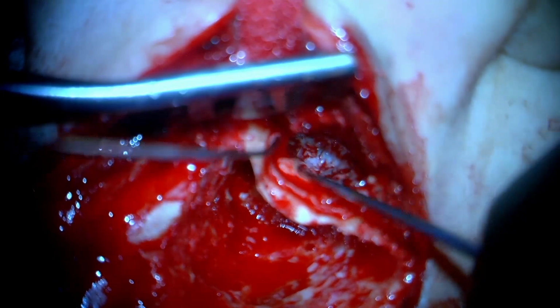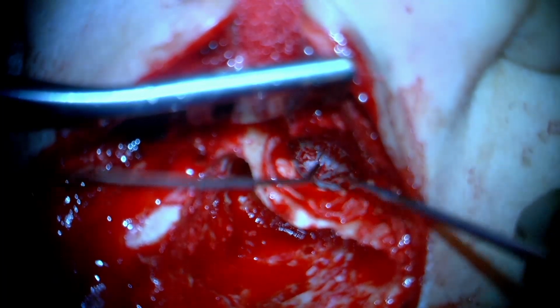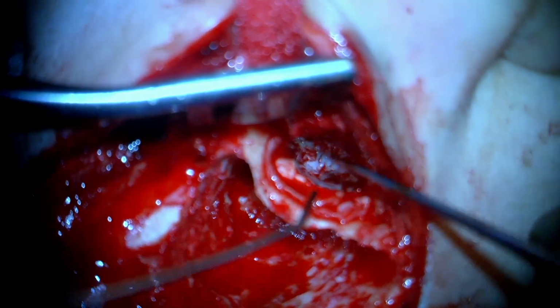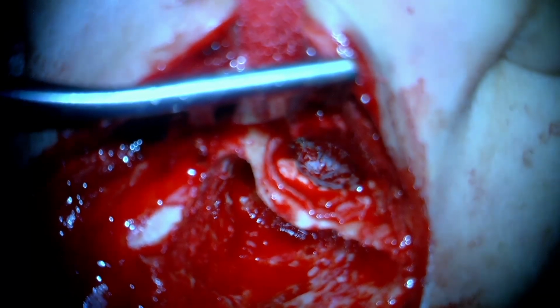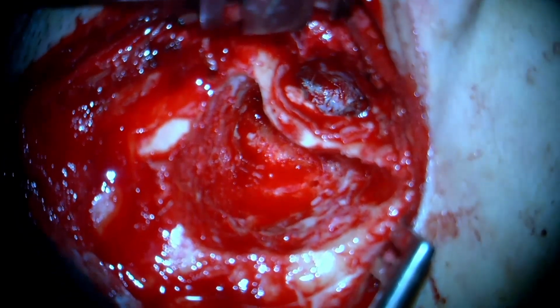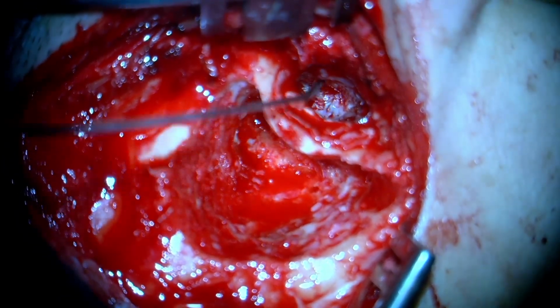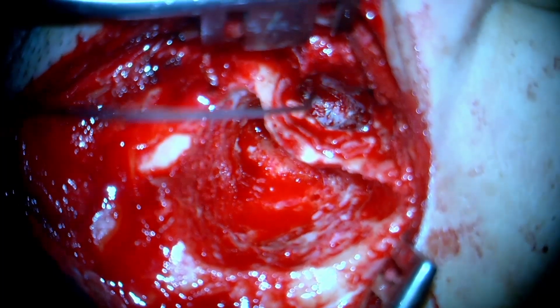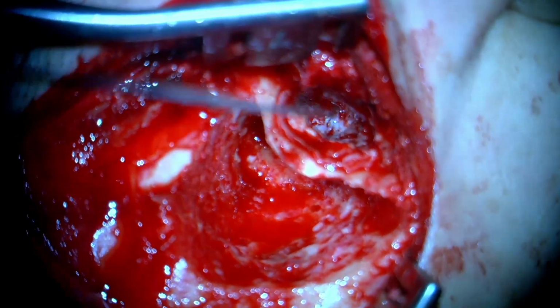Now you see that the flap has been put back on the fascial graft, and this looks like a good assembly, where the disease from both the mastoid and the middle ear has been cleaned appropriately, and we have been somewhat able to preserve the anatomy of both the mastoid and the canal wall as well as the middle ear ossicles.